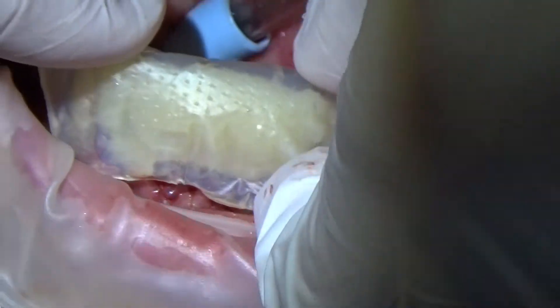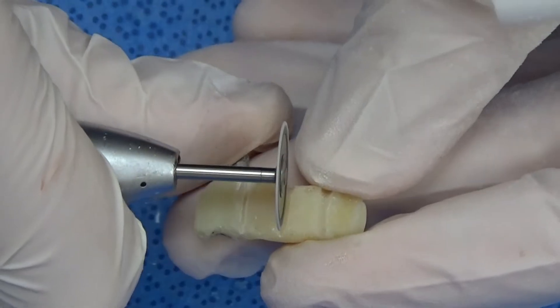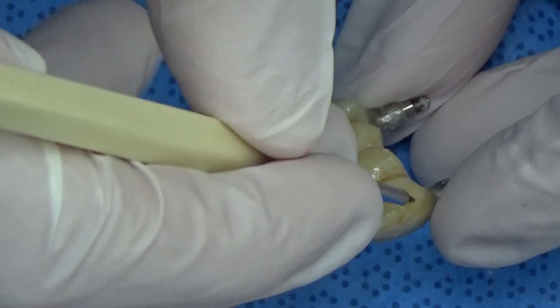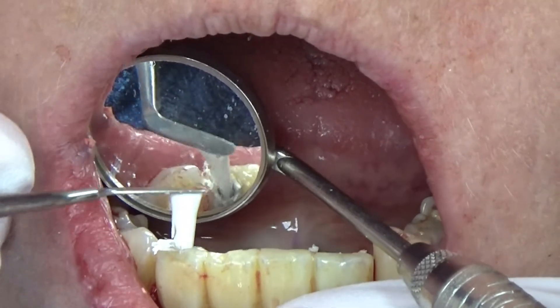I've got this clear silicon and then just fill it up with normal Visacryl — fill it all up flowable. It's all looking a bit ugly at the moment. The burs are actually designed for acrylic but they work just as well on Visacryl. I use Softlex discs as well. Now we screw it into position, and once we have that in position that's it.